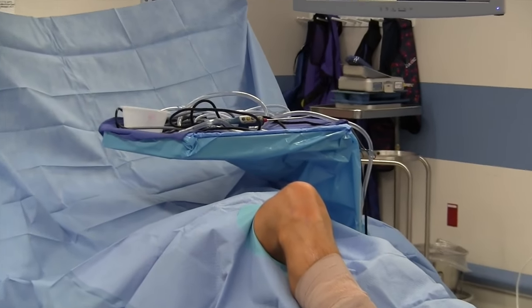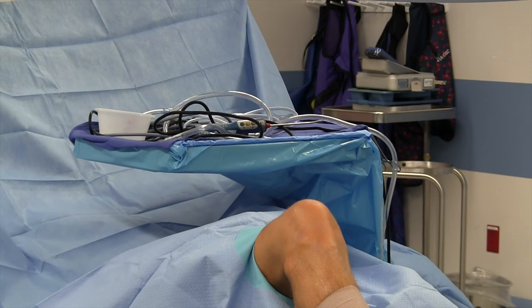The arthroscopic monitor is also on the contralateral side and positioned at a comfortable height for the surgeon. A mayo stand is brought in from the contralateral side and is used to secure tubing and as a workbench; it is placed proximal to the knee. The scrub table is positioned at the foot of the bed.